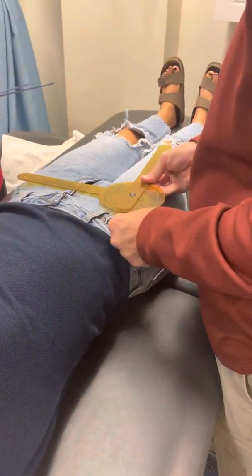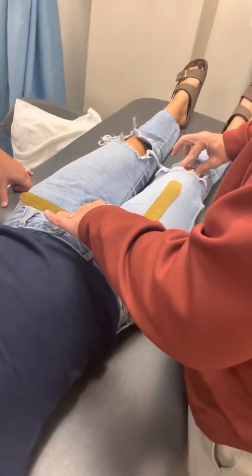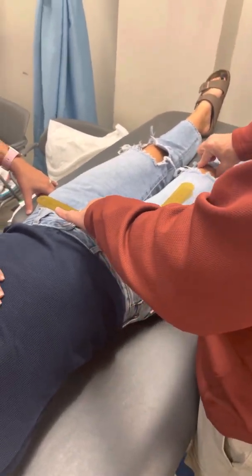So there, and then that's my starting point now, because I'm using the midline of the patella. See, your jeans don't make it easier to find the patella.